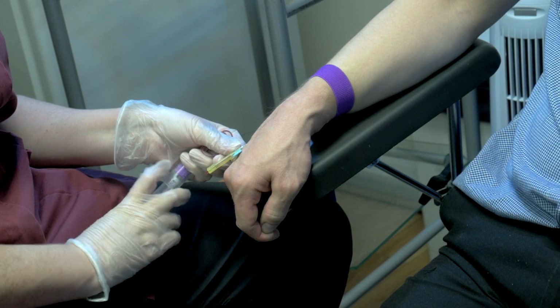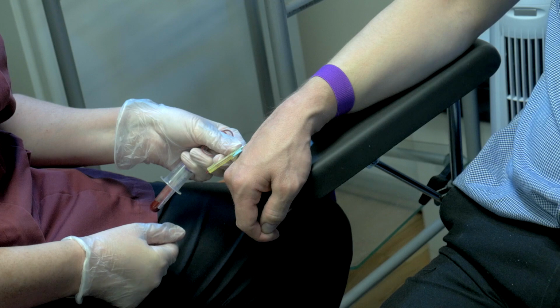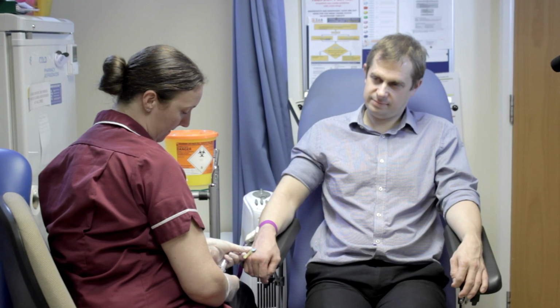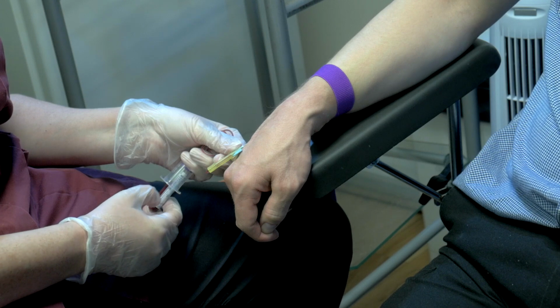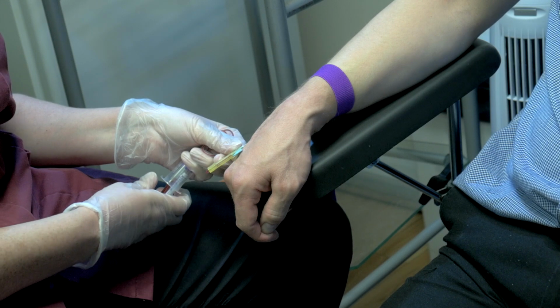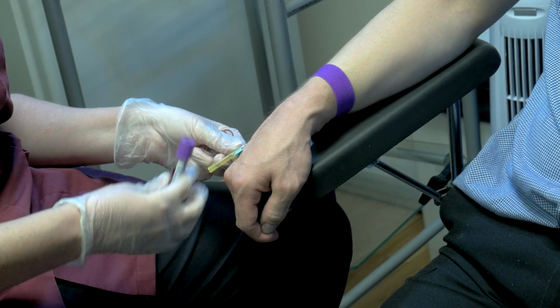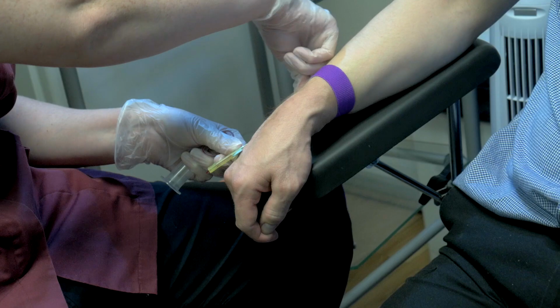So then I'll get my lavender, following the order of draw. And these can sometimes be a bit slower to fill, but they get there. And with these, the fill line, the square on the side of the label, is a white colour. So we just need to make sure we've hit that mark. Perfect. So now we're done, so I'm going to release the tourniquet.